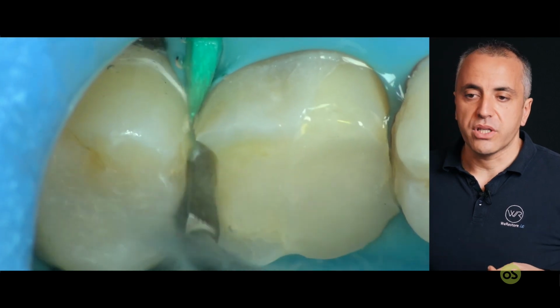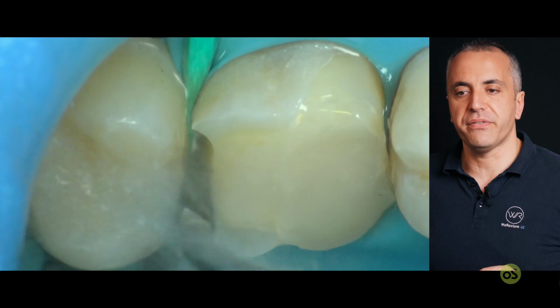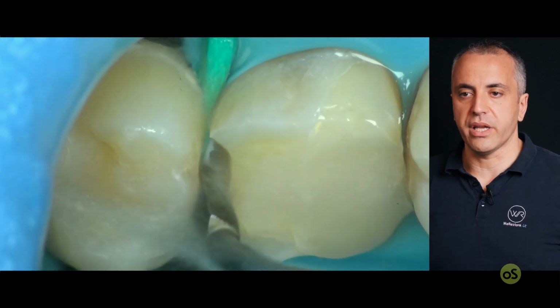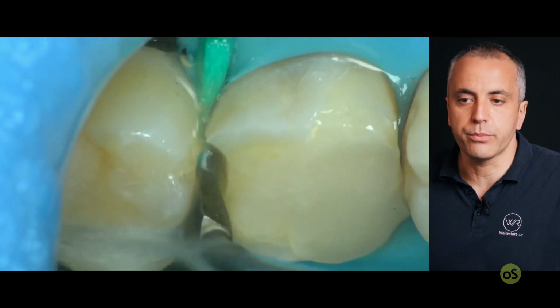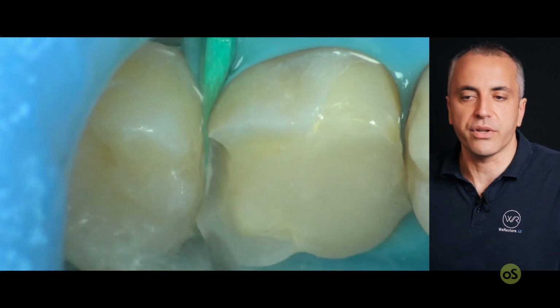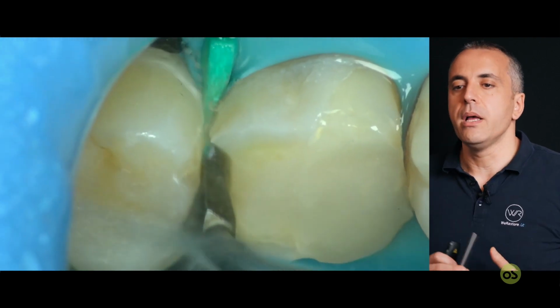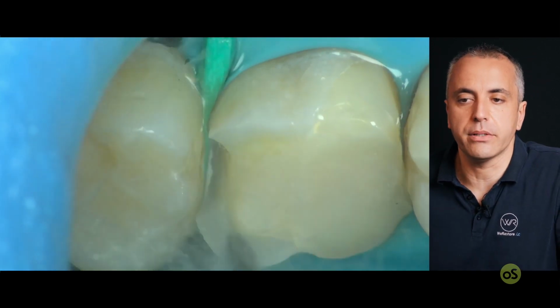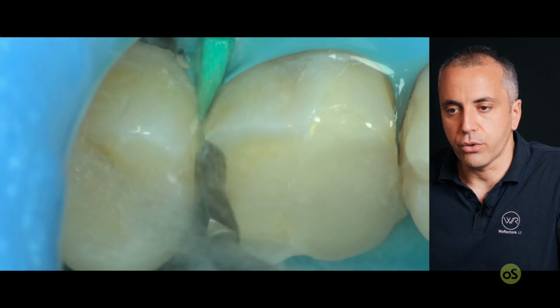There are sonic tips, there are ultrasonic tips, or there are burrs that cut on the head. In this case we use the sonic tip in order to slowly define the cervical margin, but also the axial walls of the interproximal area. As long as you see white, you have to prepare because this is demineralized. We are inside the white spot. It will become a decay sooner or later, so we have to prepare and remove all this.